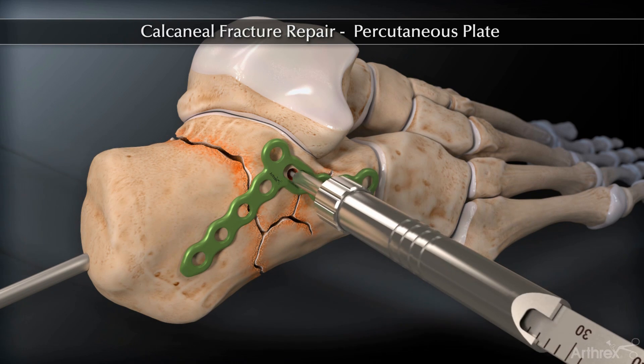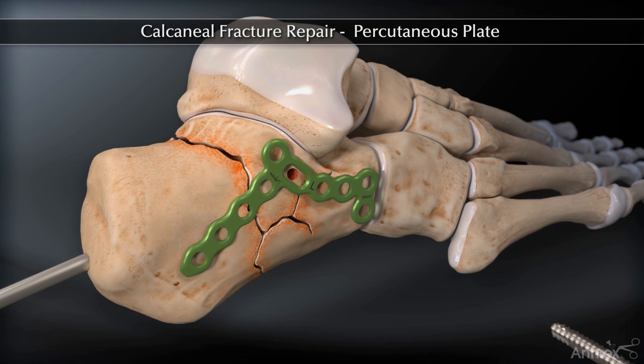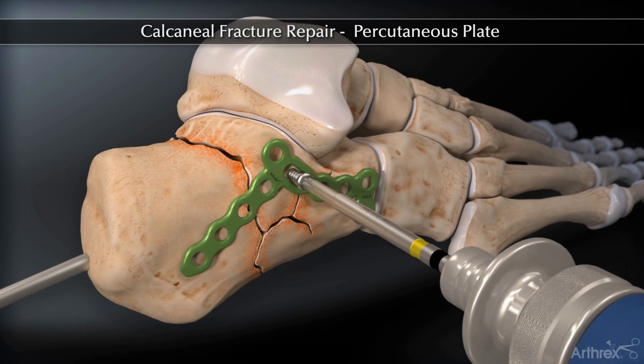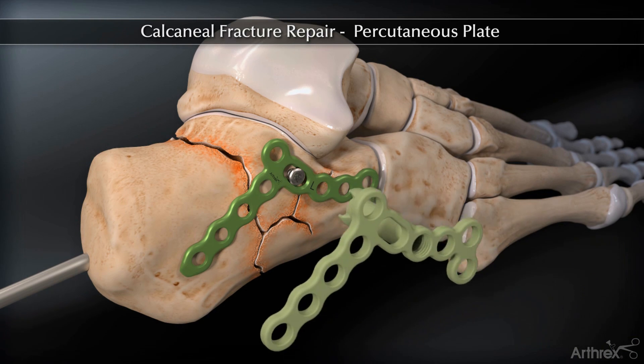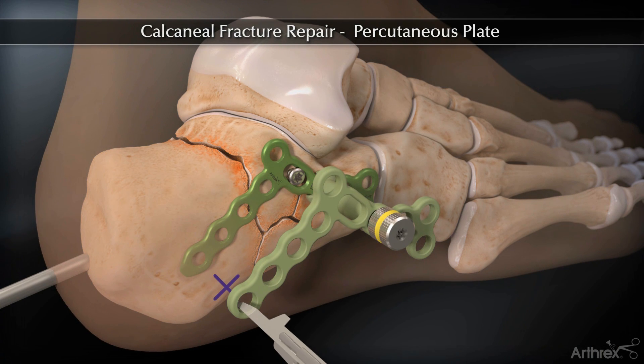Measure and insert a 3.5 mm non-locking screw. Insert the corresponding percutaneous guide and connect the guide to the plate with the attachment screw. Mark the skin and make a stab incision.